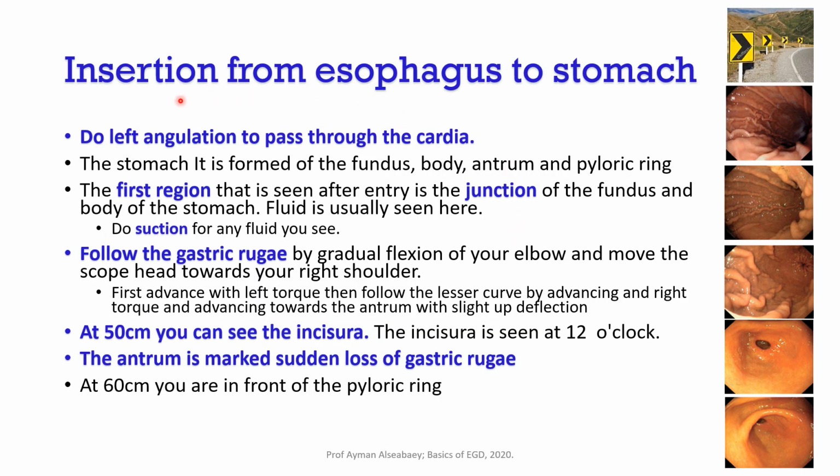How can I go from the esophagus to the stomach? As you are driving, you should follow the traffic signals. If I drive my car and I see these arrows, I will know that this road is curved towards the right.